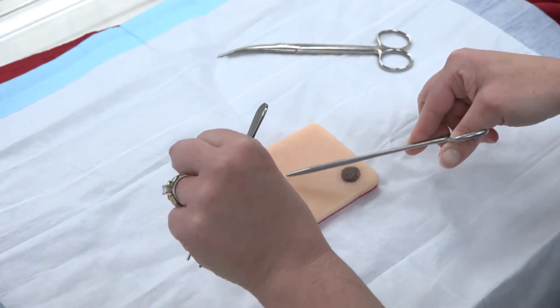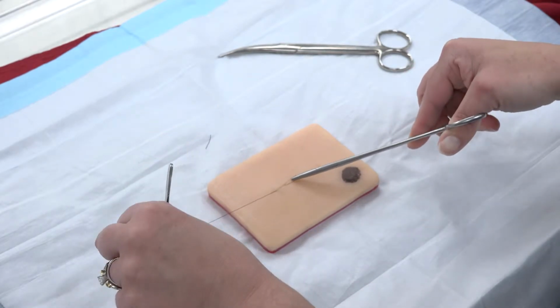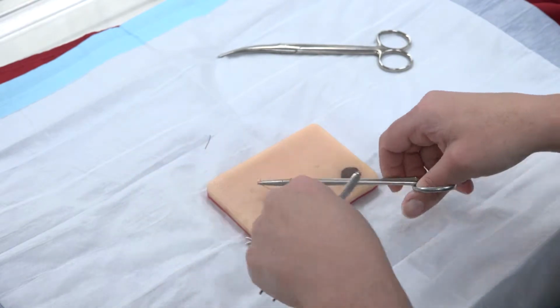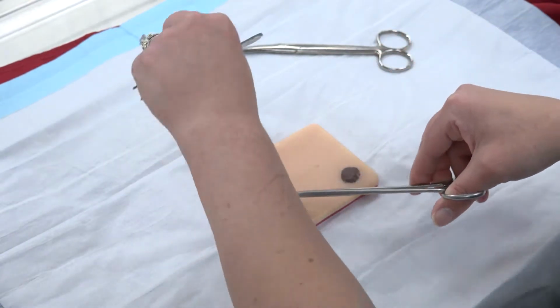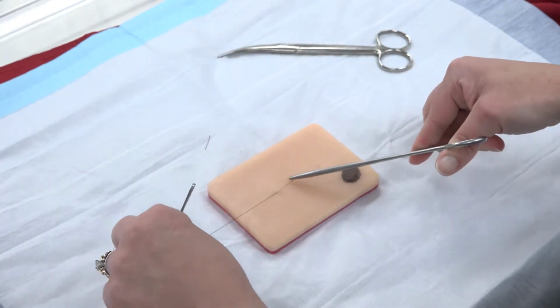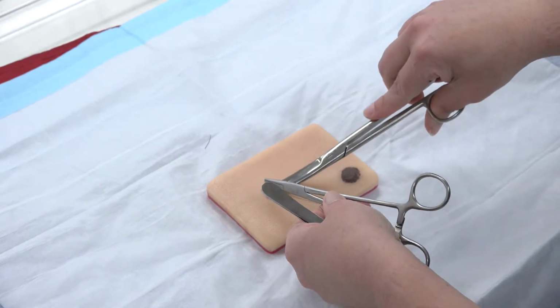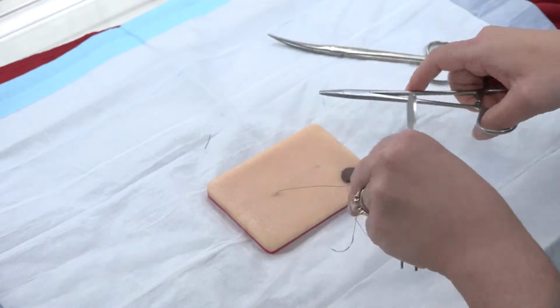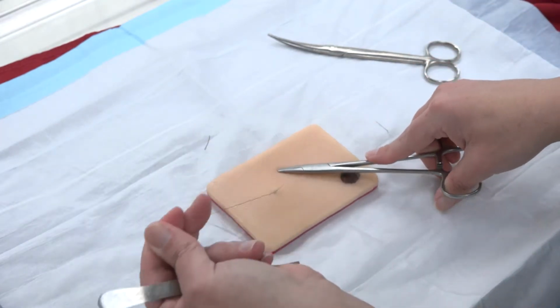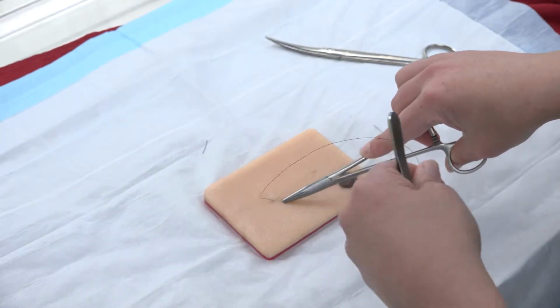Now you will find that your knot sinks down better if you pull the same direction as the incision is. So parallel to the incision, as opposed to this way, I'm pulling it that direction. Okay, so I do my four throws. Now I've got to cut my tail so that it stays low. So now my knot is low, and if I'm just sitting here like this, you can't see my knot. If I pull on my needle though, I can make you see my knot. And so that's what happens.